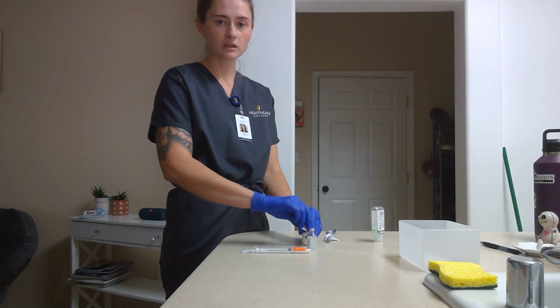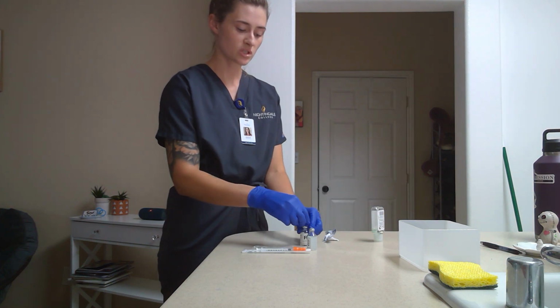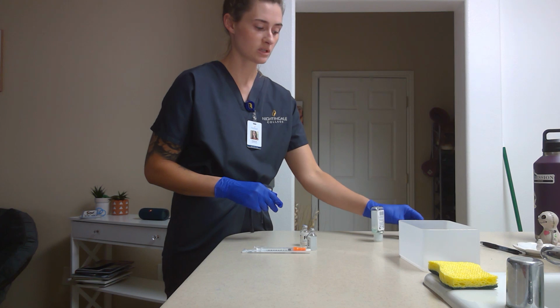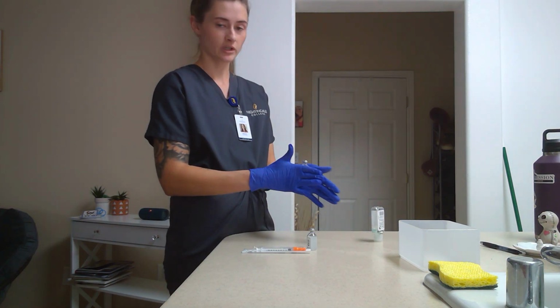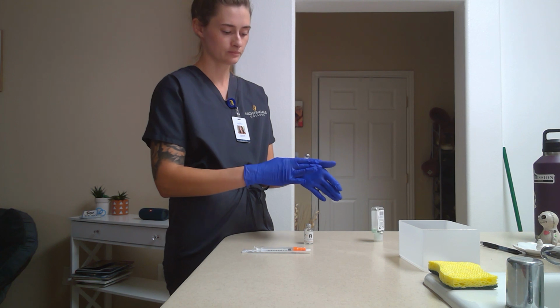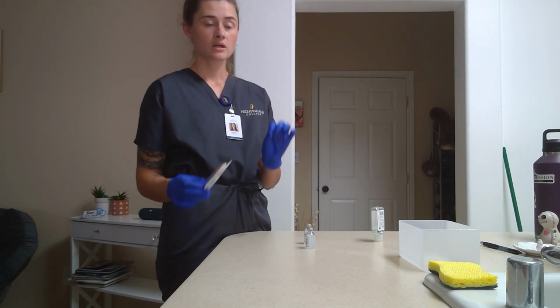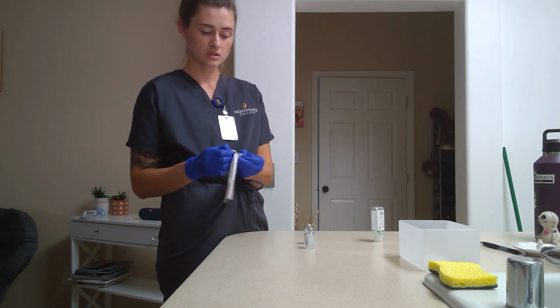And with the insulin, it's really important, if it has been refrigerated, which some insulin is, it's important to let it sit out until it reaches room temperature. And then I'm going to roll it. You're not shaking it, just rolling it. Don't touch the top, it's already been cleaned. Just roll. Okay, and now with this, we are going from clear to cloudy.